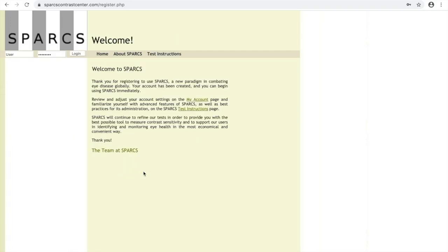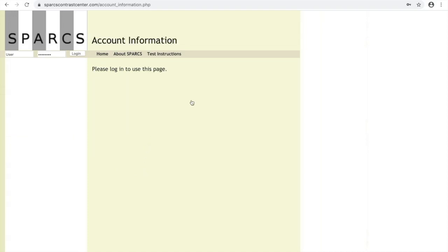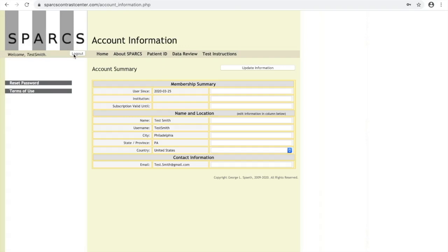Once you have registered, you'll probably want to click the link to see your account, but you have to log in first. You can then, once you've logged in, make sure your information is accurate and start registering your patients to be able to take SPARCS at their home.